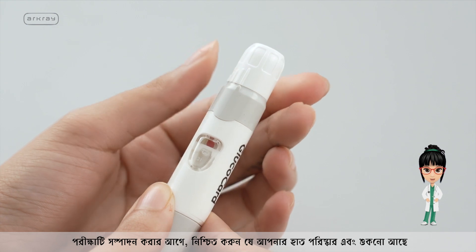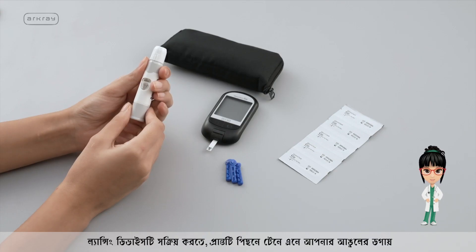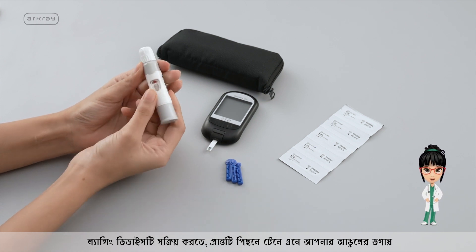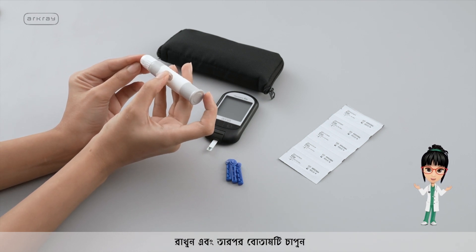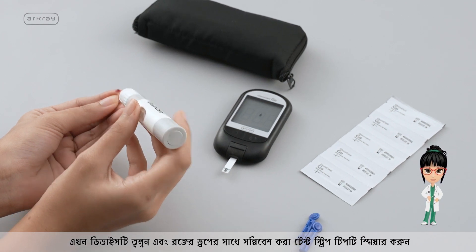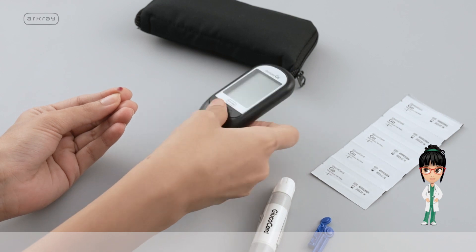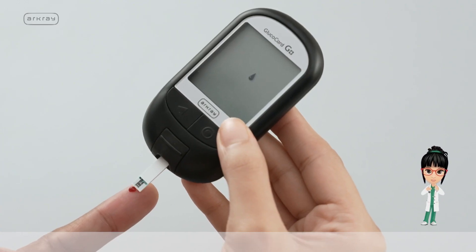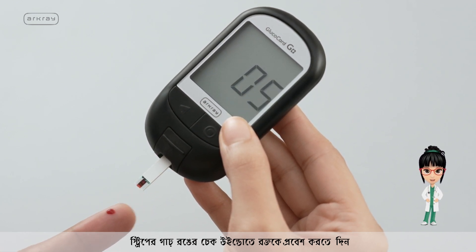Before performing the test, ensure your hands are clean and dry. To activate the lancing device, pull back the end and position it at the tip of your finger, then press the button. Pick up the device and smear the inserted test strip tip with the blood drop. Hold the device tightly with your fingertip and allow the blood to seep onto the dark colored check window on the strip.